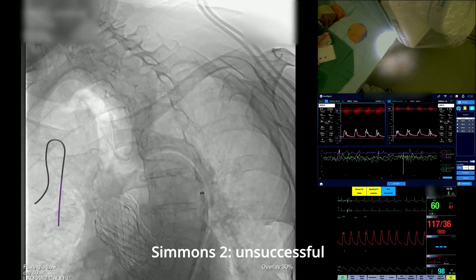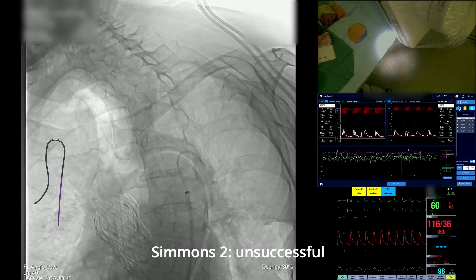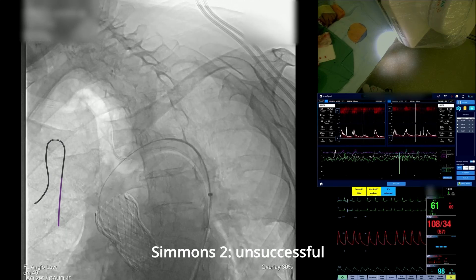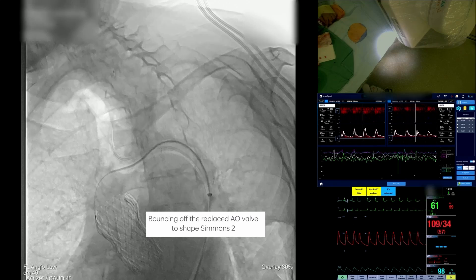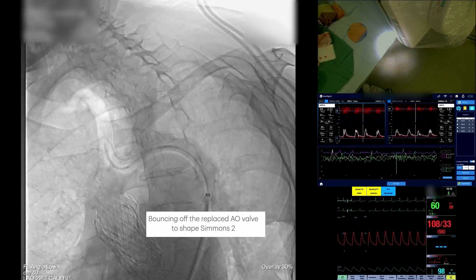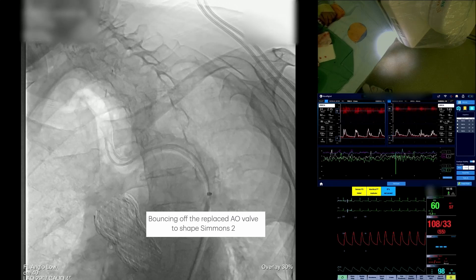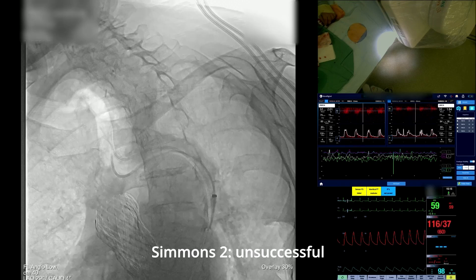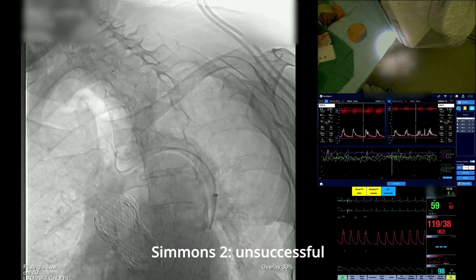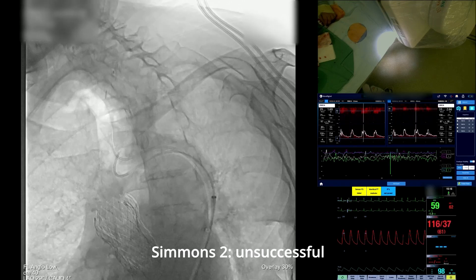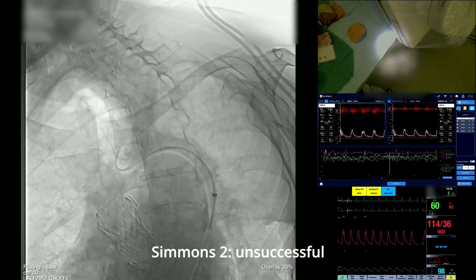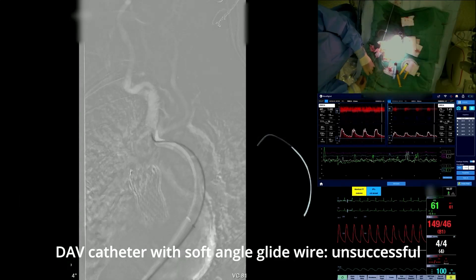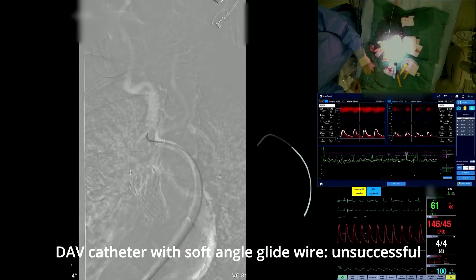The Simmons II catheter is a sharp-angle pre-shaped catheter usually fit for engagement of the supra-aortic vessels, but the bovine arch anatomy in this patient made cannulation of the left side difficult. A double-angle vertebral catheter with a soft-angle glide wire was then brought in to cannulate the left CCA, but those attempts were again unsuccessful.